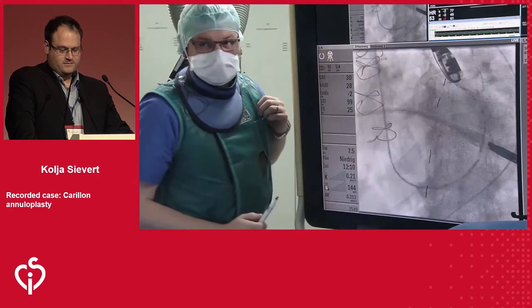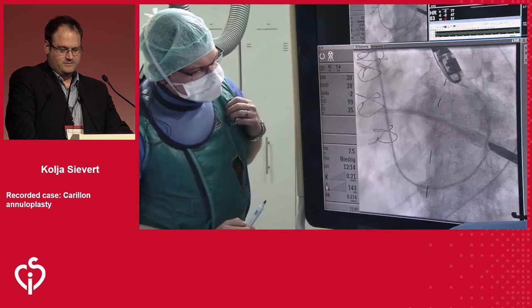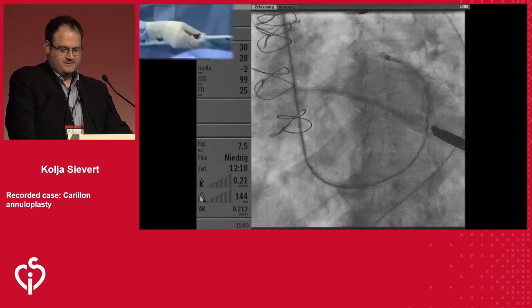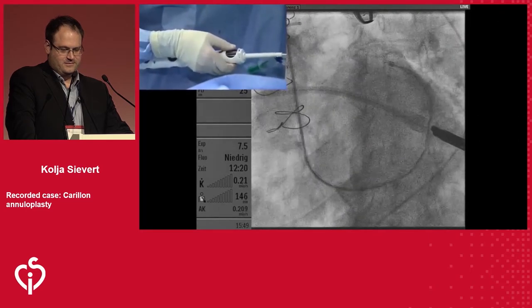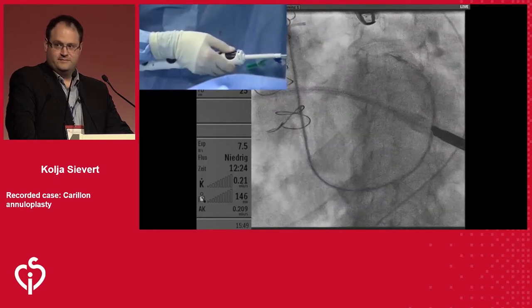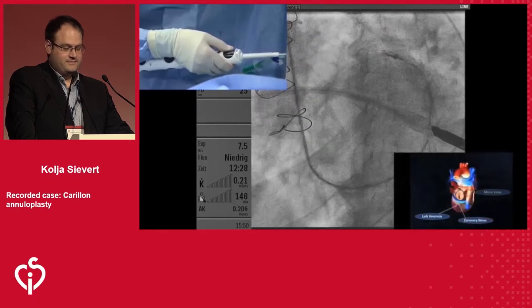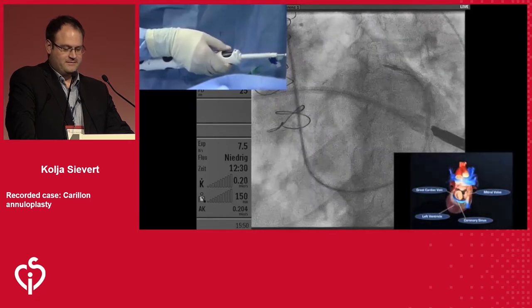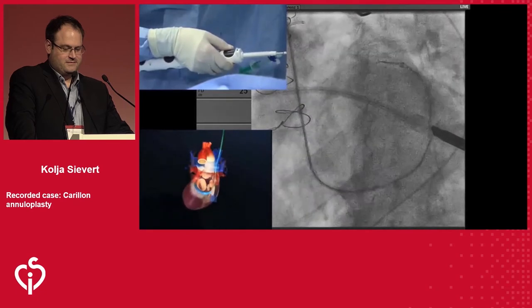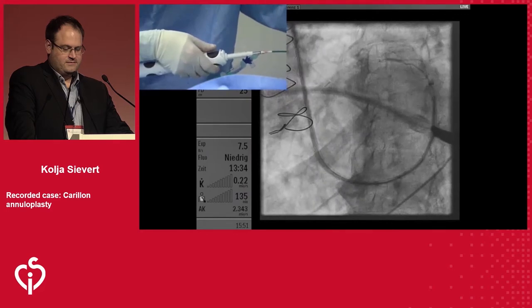So now I'm at the tip of the sheath, and you see that it came back a little bit. So I'm continuing to rotate into the black direction. Now the anchor is coming out. At the same time, I'm gently pulling on the guide. This is a really nice position. You're exactly at the target zone. Everything looks good. There it is. Yeah, there it is. So it's out.